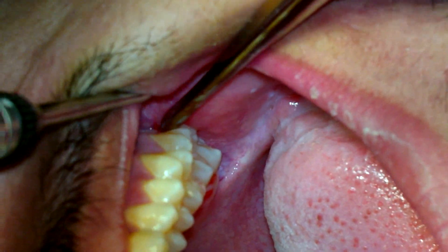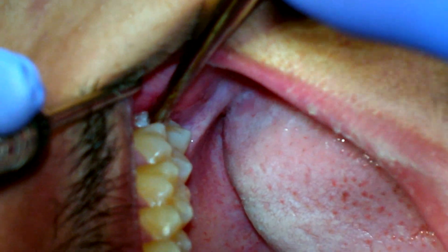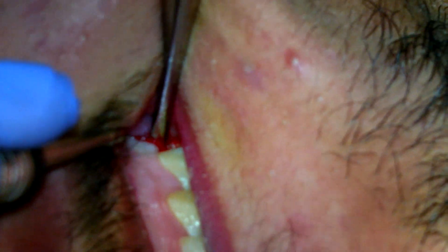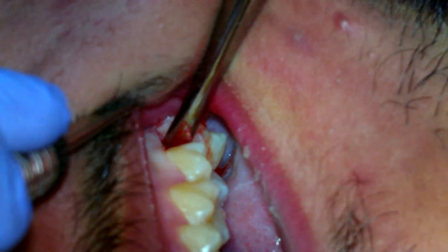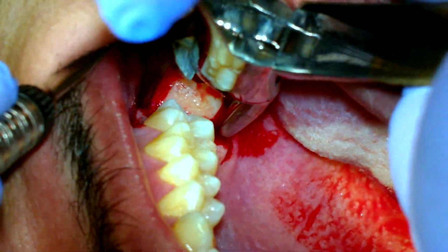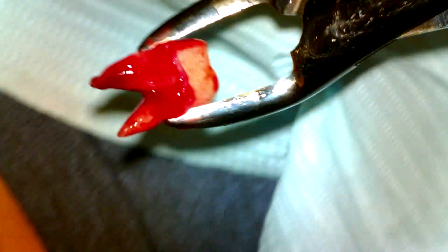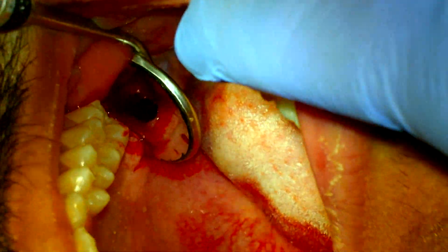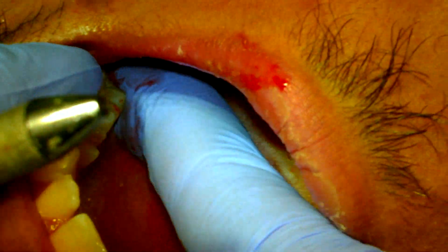Turn towards me some more. Close your mouth just a little. Because I use a straight elevator — this is only my preference, there are some angled elevators — I'm having him close his mouth so I don't have to stretch him like a gummy bear. And there you go. Because of the roots diverging, it wasn't coming up. Making sure nothing's up there, nothing sharp. Good. Done with that one.